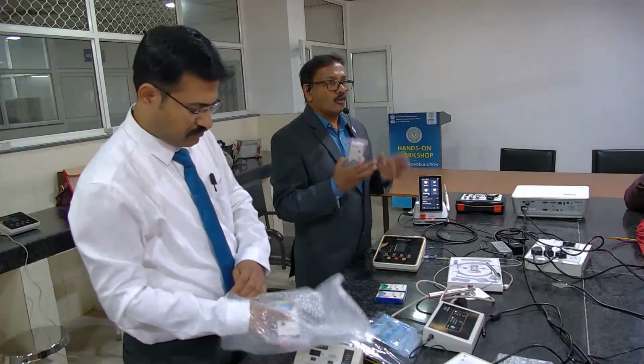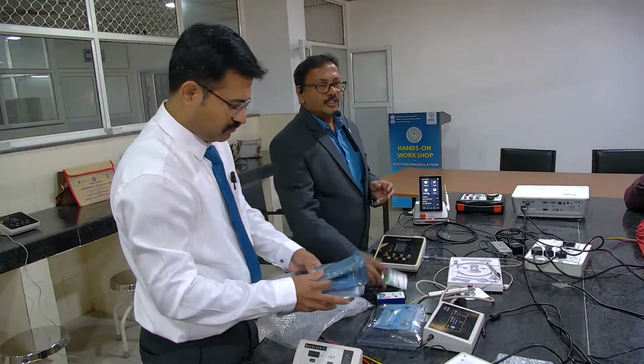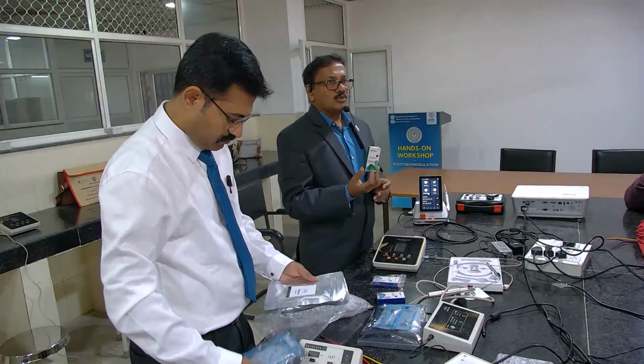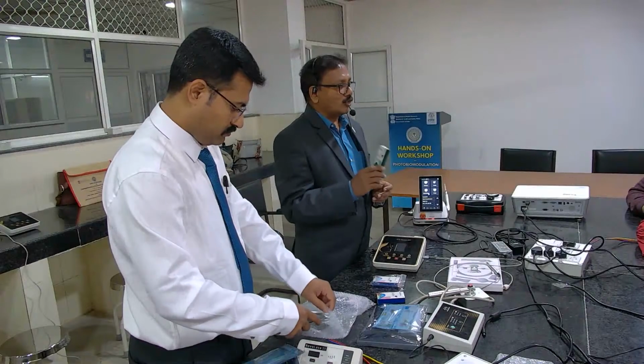Because we have got something called optical affinity for the dyes. When you're using blue, you have to use only 660 nanometers. When you're using green, indocyanine green, it's always 810 nanometers. So instead of falling into the trap of the dealer that ours is 10 watts, 9 watts, 8 watts, don't quote the watts. That's not the right question.